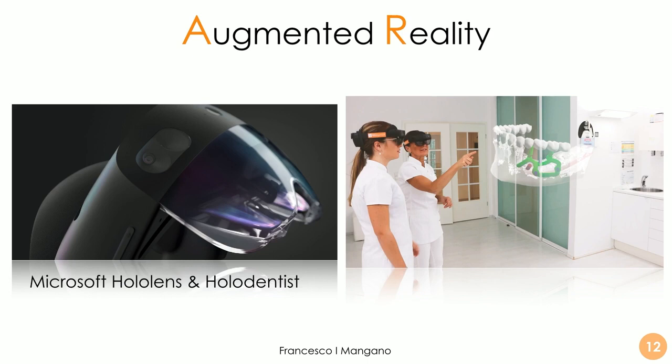This is a beautiful tool, augmented reality, to communicate between colleagues, to communicate with the dental technician, because we can see the 3D model of our patient gigantic in the middle of the room, and we can discuss eventually treatment, procedure, protocol. Also, we can explain to the patient what kind of treatment we are planning to do with them, and that will help, of course, to increase the compliance of the patient, at least, and the patient can accept the therapy easily because it's very visual and very immediate and very fascinating.